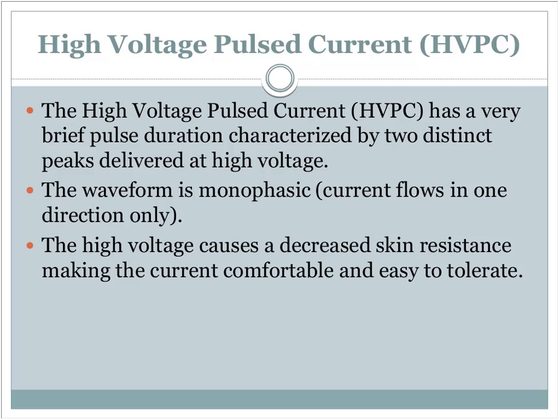So this gets into, well, how do you know which one to put on? Typically, with a wound in the initial stages of healing, you want to use the negative electrode initially. We can talk more about wound care maybe on another WebEx, or if you have questions specifically, you can contact me.